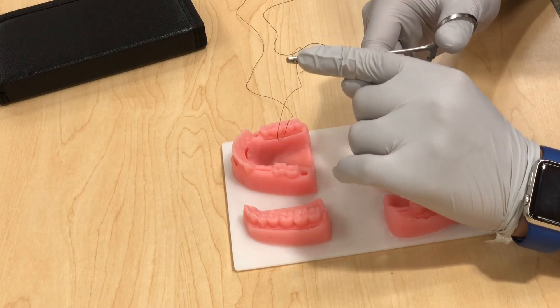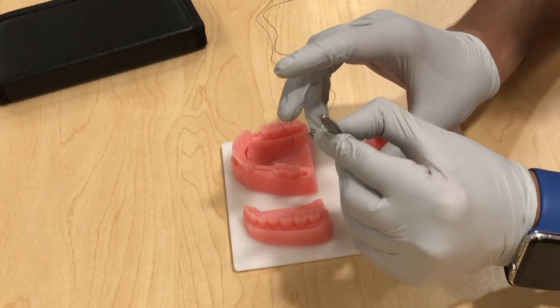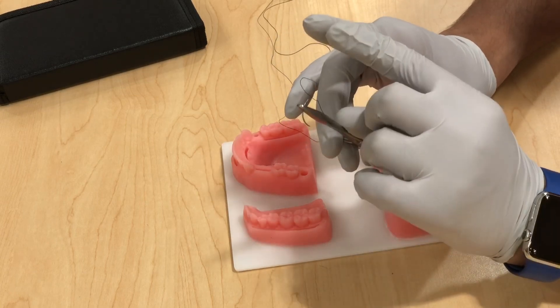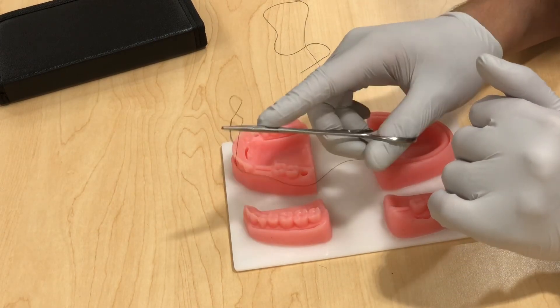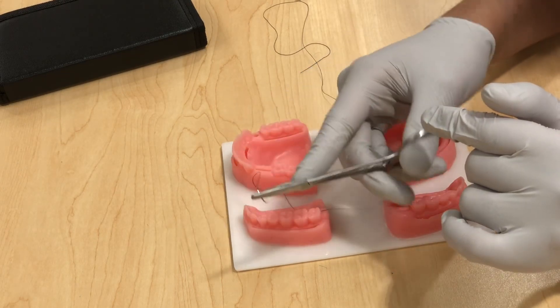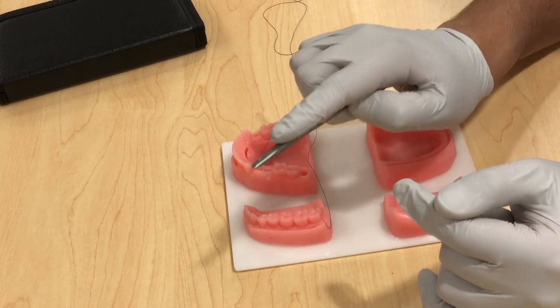The correct way to hold the needle holder is your thumb in one ring and your ring finger in the other ring — not your index finger and not your middle finger. Your index finger should go straight to help maneuver and direct the needle, and the middle finger should help secure the grasp. Another technique is pipe palming the needle holder, which gives you more freedom of rotation and movement.